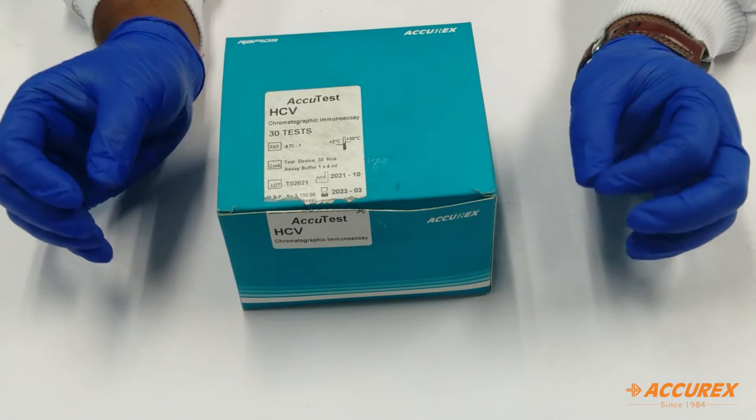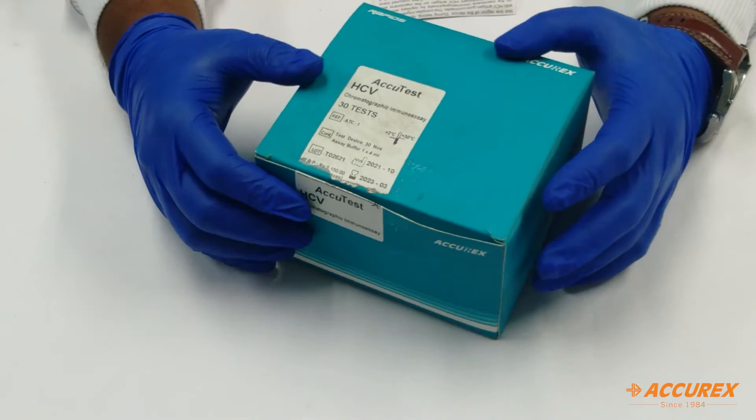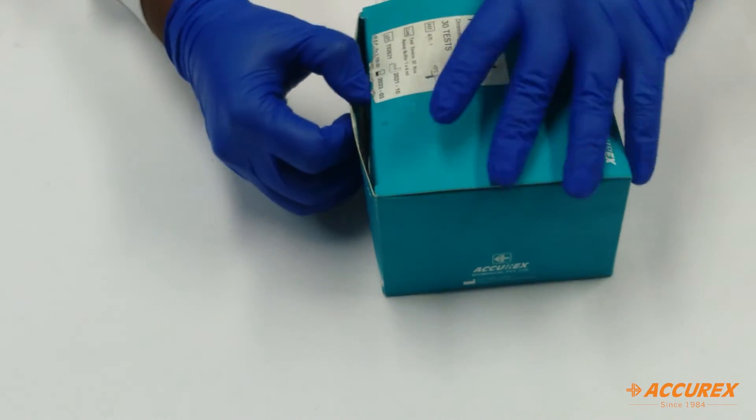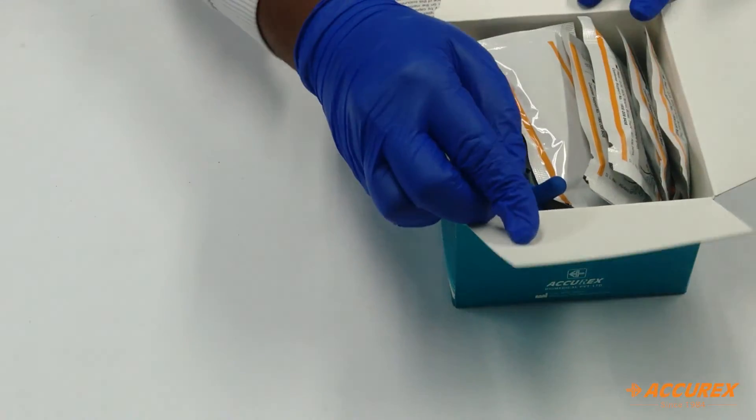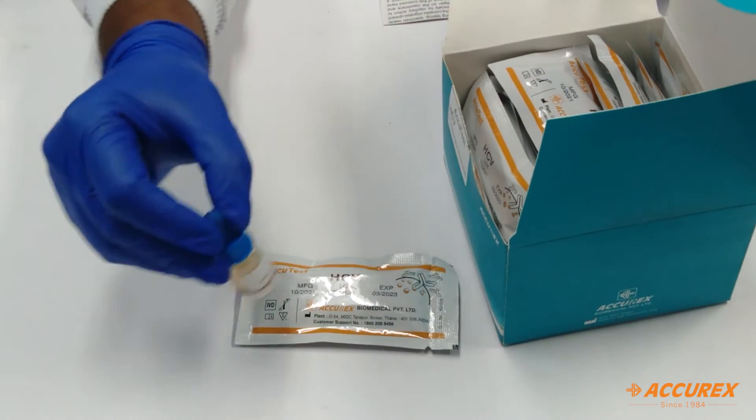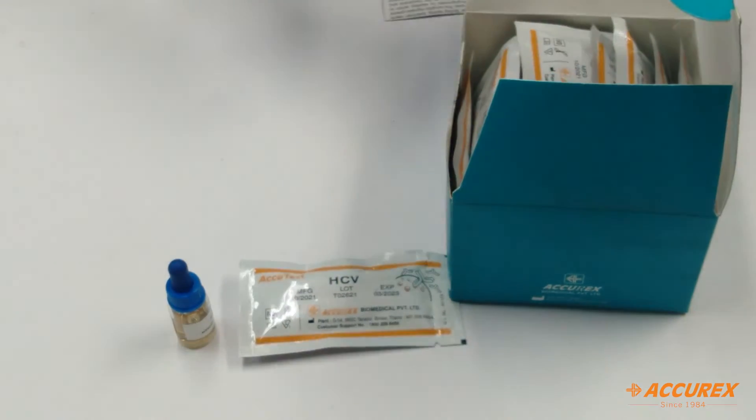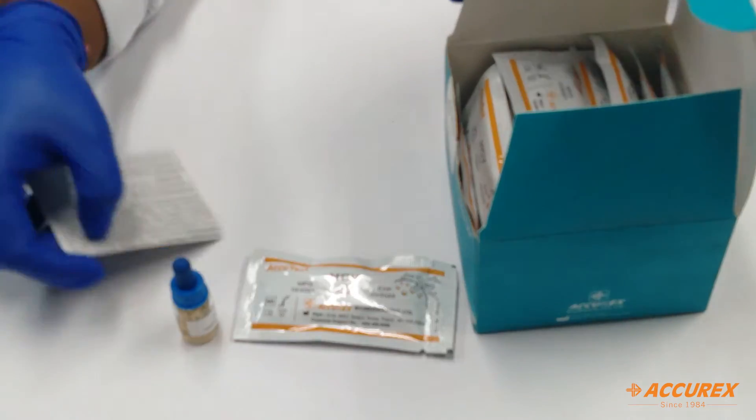For the components, what comes inside the box: here you can see the HCV test card, one buffer, and also you will find the pack insert. This pack insert you can use for reference on how to do the procedure and how to follow it.